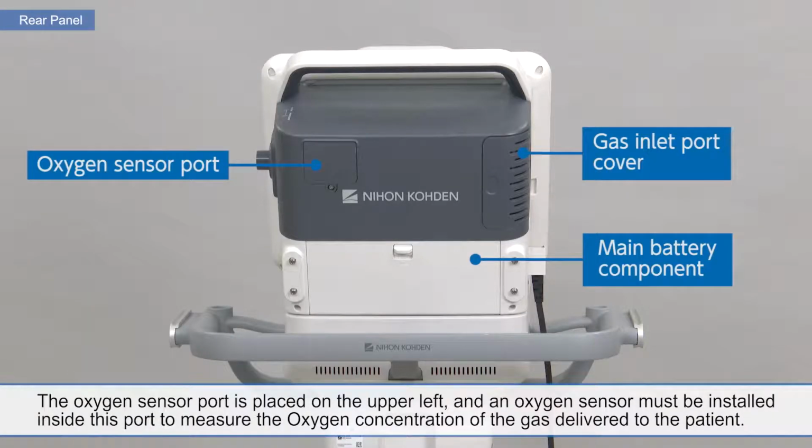The oxygen sensor port is placed on the upper left, and an oxygen sensor must be installed inside this port to measure the oxygen concentration of the gas delivered to the patient.